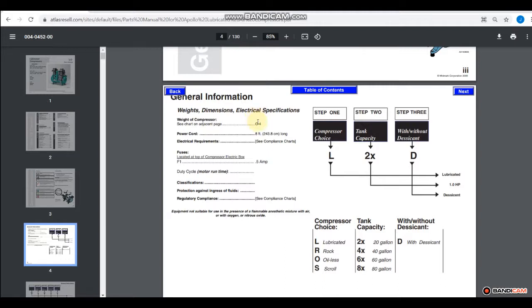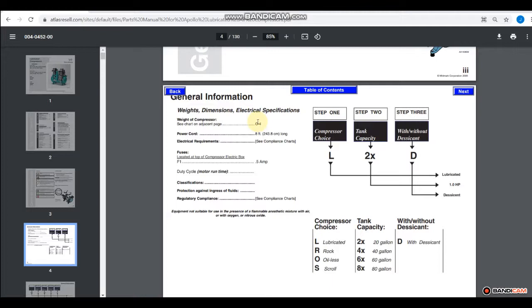Now there is a wide variety of differences between these different models of compressor, and so the way that Midmark or Apollo did it was they tried to give you a code or a key to understand what the model numbers mean. This is something that is good to know because manufacturers will at times try and give you information in the model number of a piece of equipment they manufacture. So let's go ahead and work through this chart and see what we can understand from it.